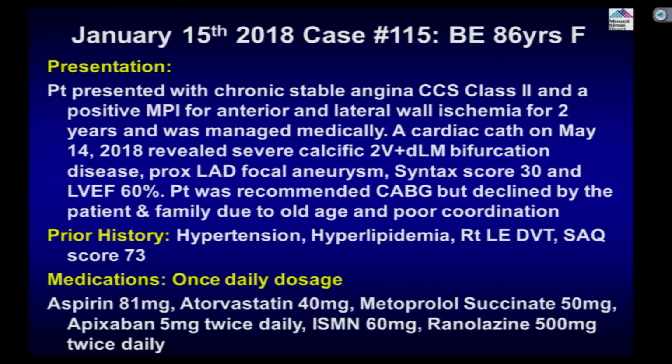No, so we'll IVUS into the LAD. You want to see the wire go into the circ and IVUS, because if you need to document circ disease or no disease, we have to IVUS into the circ also. We'll see, or you can see the ostium, you may not.